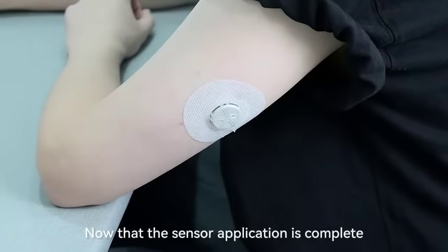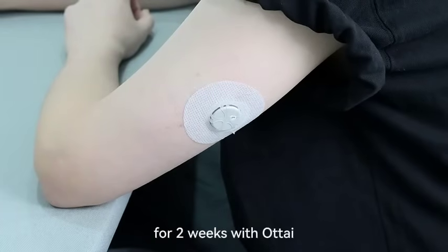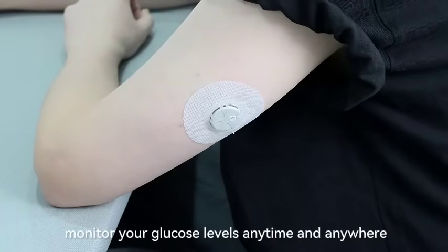Now that the sensor application is complete, please enjoy real-time, pain-free glucose monitoring for two weeks with Otai. Monitor your glucose levels anytime and anywhere.